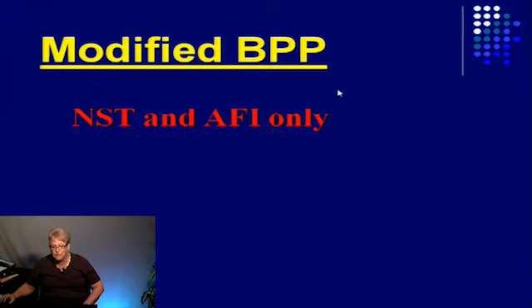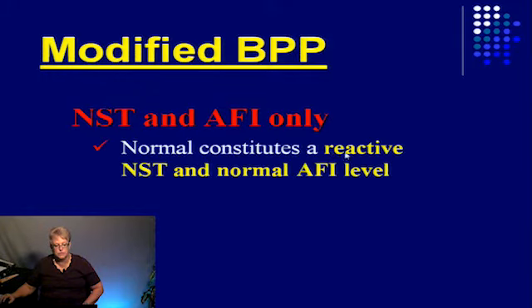So now there is a modified BPP out there, which is just the NST and AFI only. This is one we actually have our nurses doing. We've trained them how to do the AFIs, and they're very good at doing them now. So it constitutes a reactive NST and a normal AFI level.